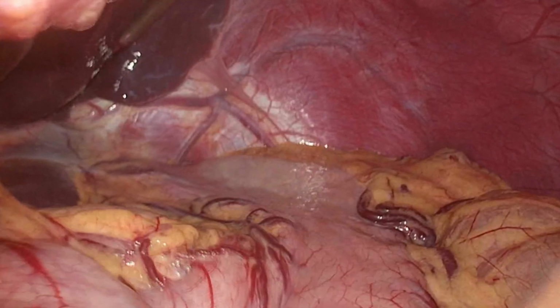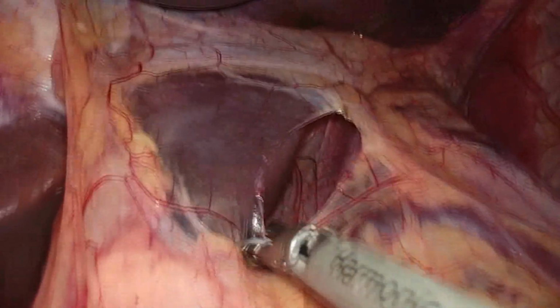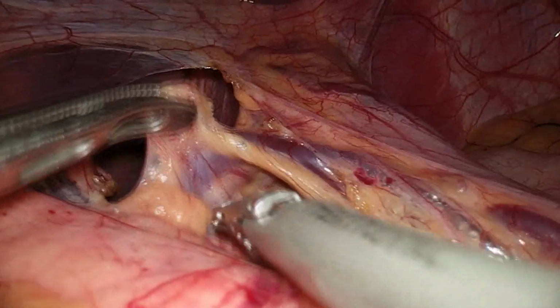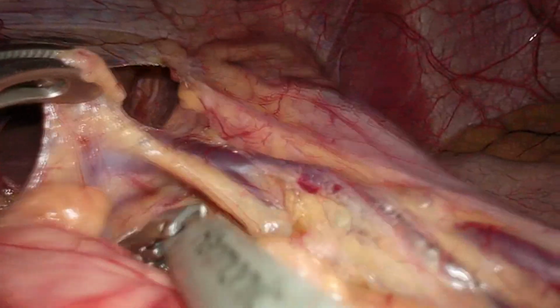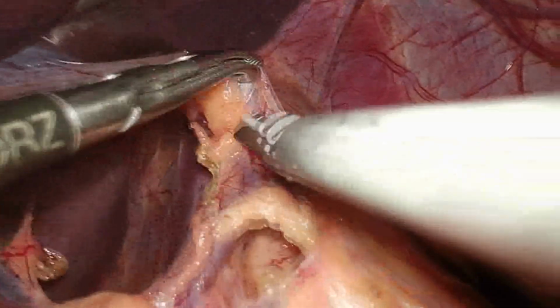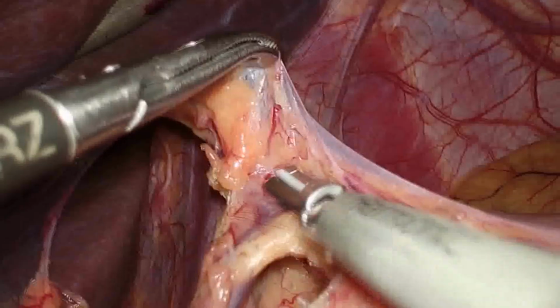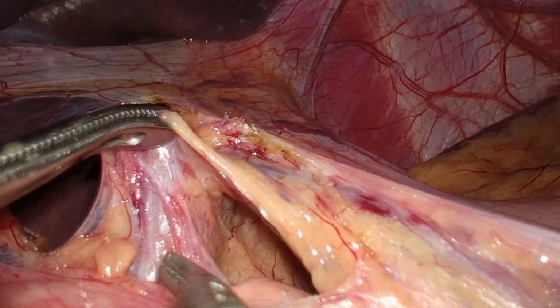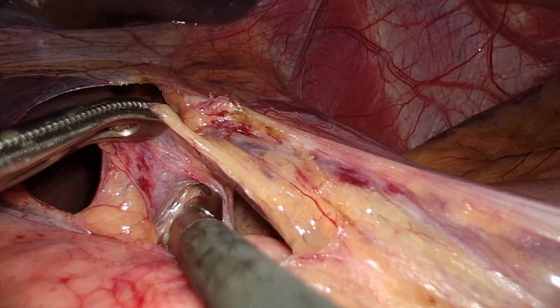So the trick here is, once you reach the lesser curve, you dissect in the lesser curve and identify the left gastric vessels. So this is the opening of the pars flaccida, and that's the left gastric vein which is identified here. The artery will be beneath it. All the tissue around the celiac trunk has to be dissected.